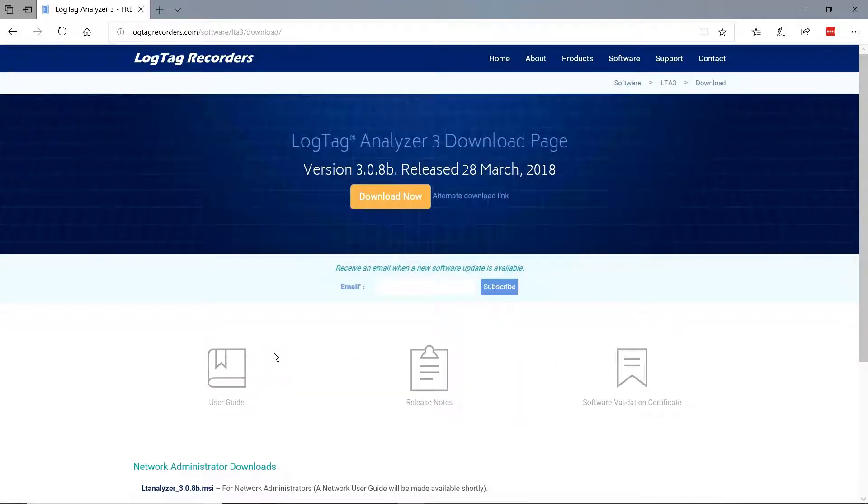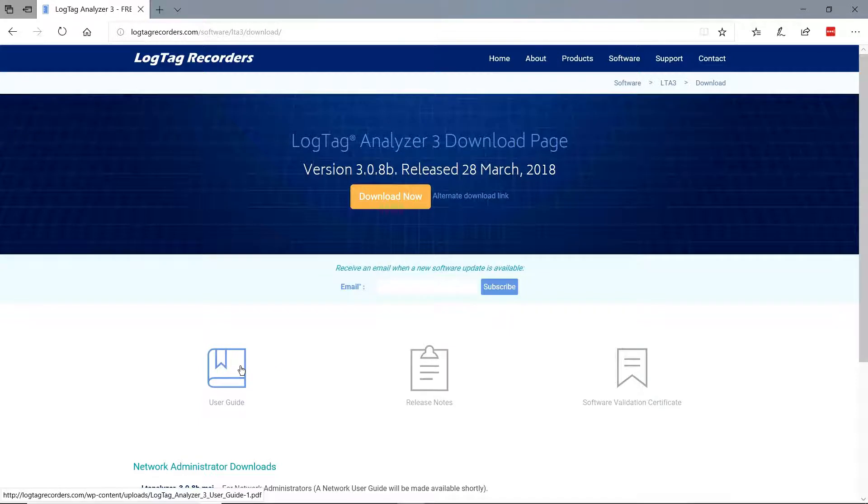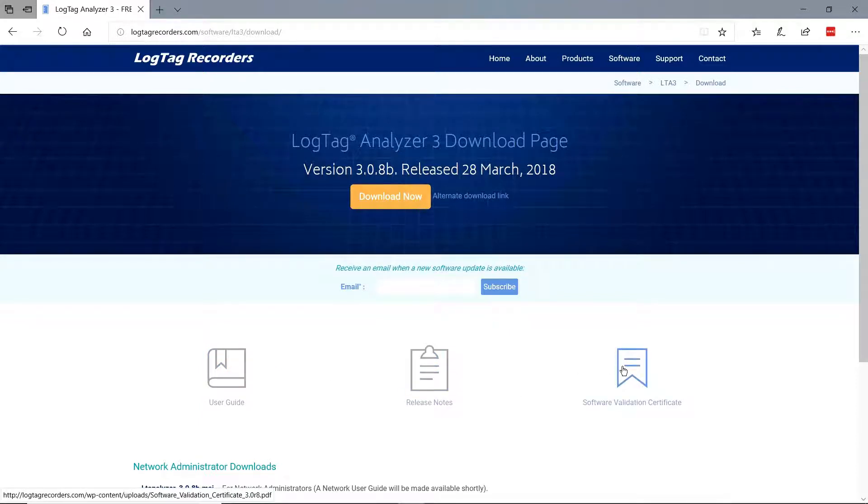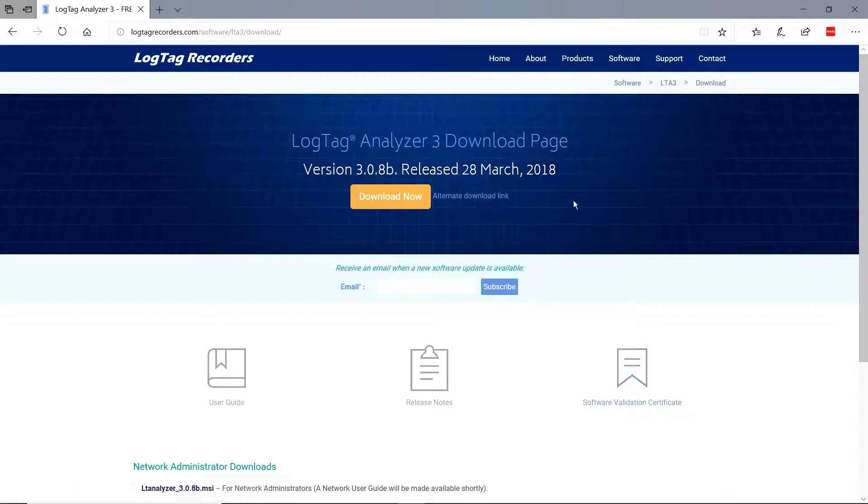On the download page, you also have available the user guide, release notes, and software validation certificate if required. Click Now for Software Download.